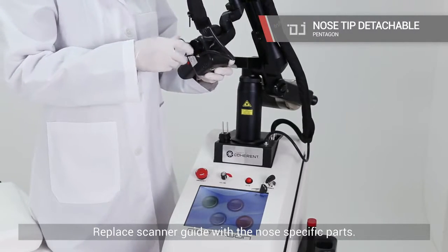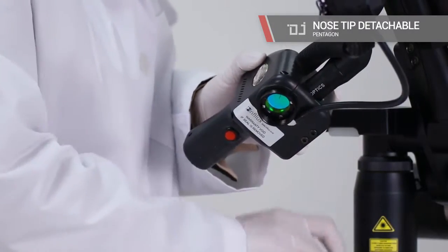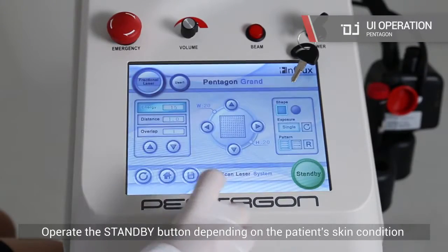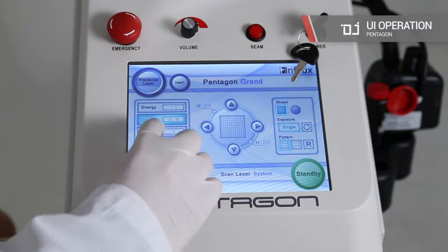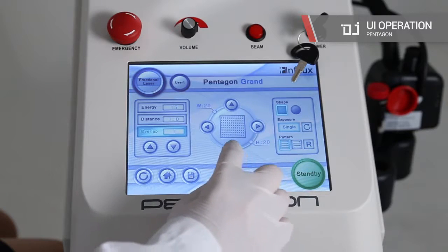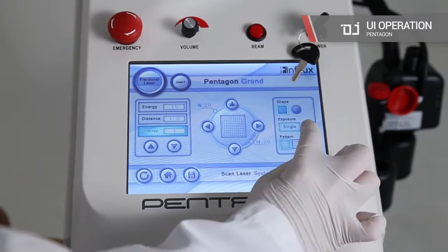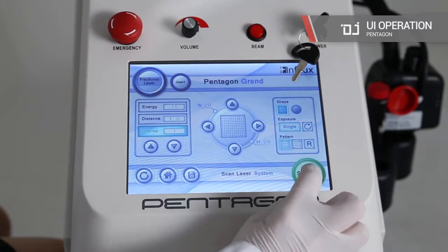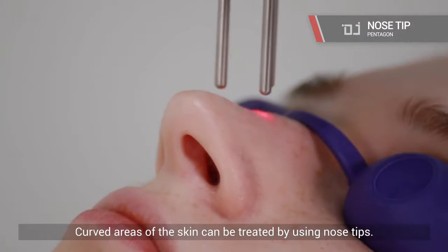Replace the scanner guide with the nose-specific parts. Operate the standby button depending on the patient's skin condition after setting the value on the UI. Curved areas of the skin can be treated by using nose tips.